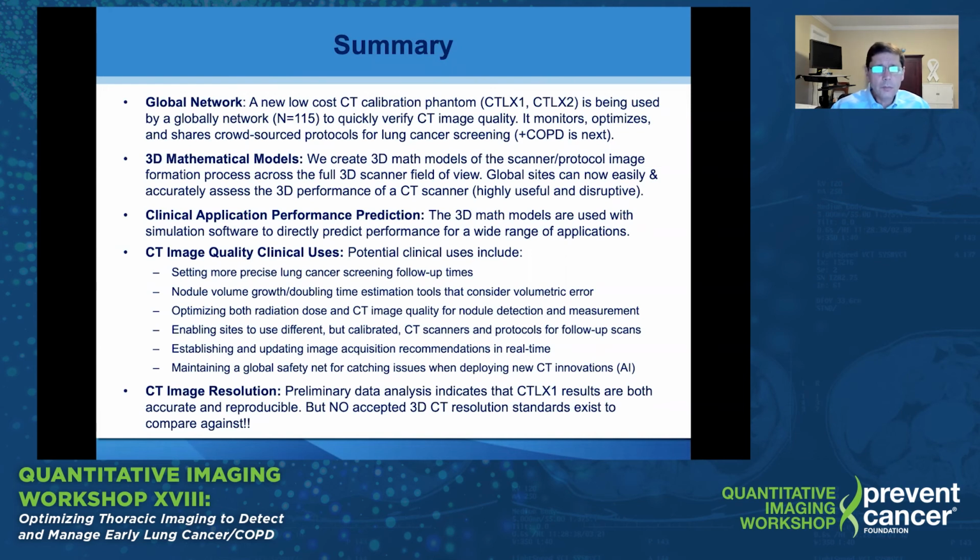Now, it's important to recognize that these types of phantoms produce 3D mathematical models, and those models then can be used to predict performance for different clinical applications.